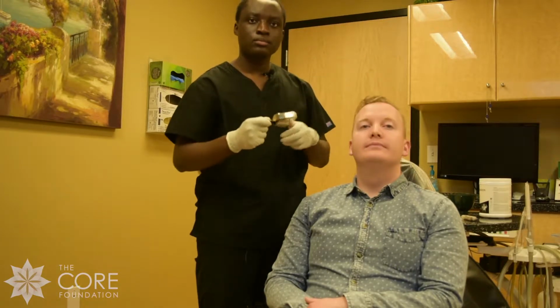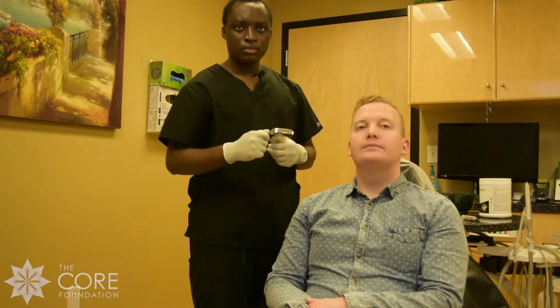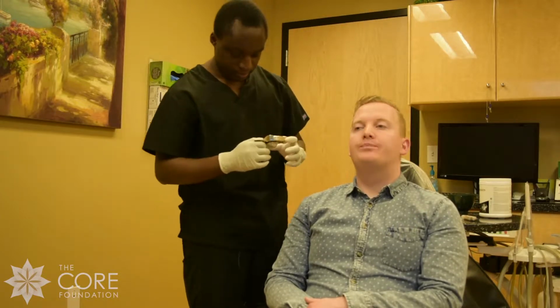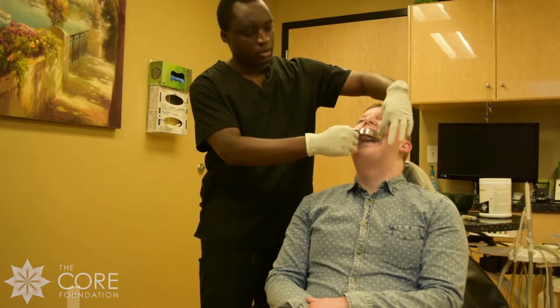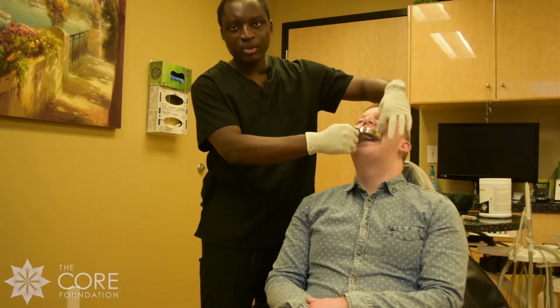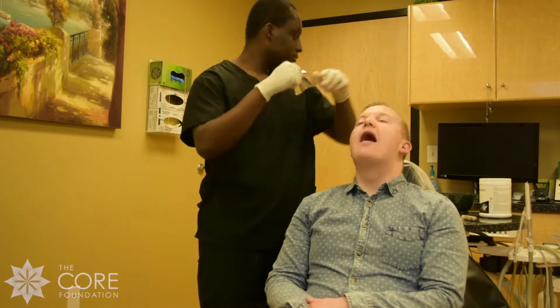So go back to that pose that you were in. And go, as you can see, the large won't fit because it cut out again right there. Just get back to the same pose. As you can see, the large tray will not fit in, so it will not work on him.